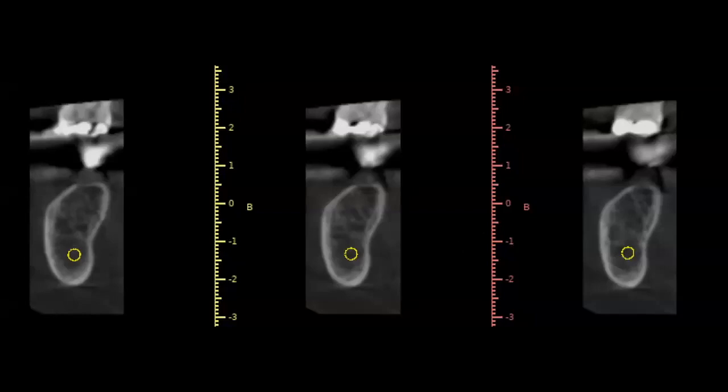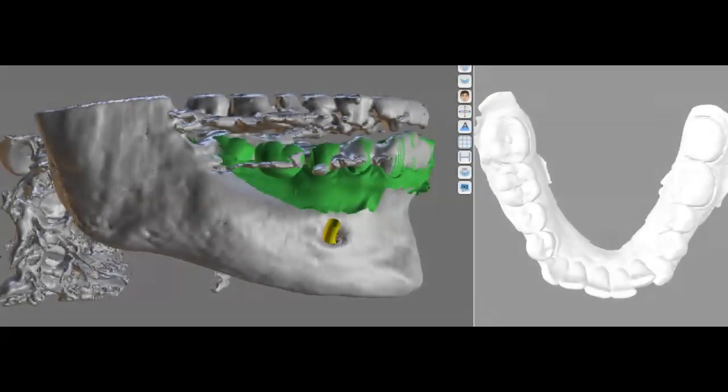So you can see I've selected the site, site number 30. You can see the quantity of bone, height, width, everything is there. Now what I'm going to do is import my STL file with the wax-up. I like using a different software, which is a free software as well, called Meshmixer, to fabricate my wax-ups. But you can use, they have a digital library.